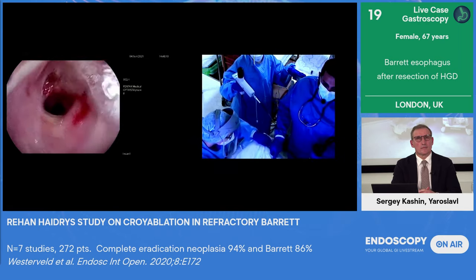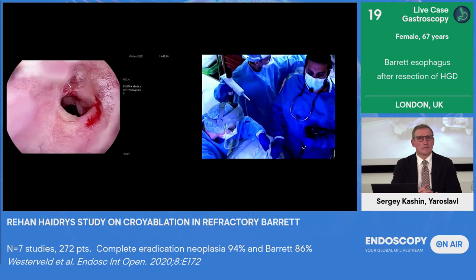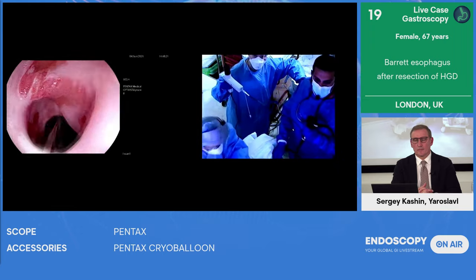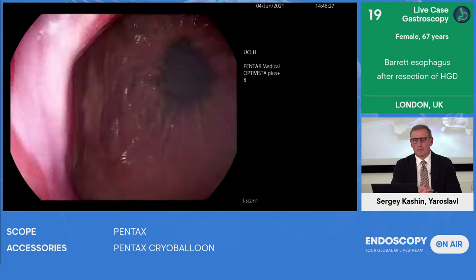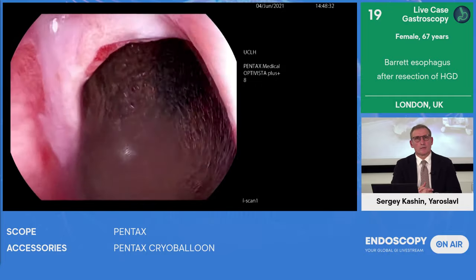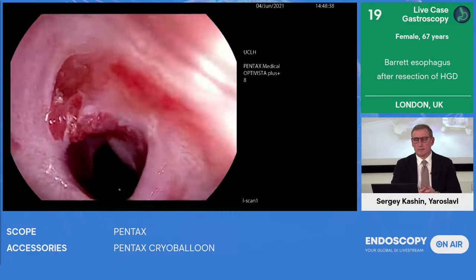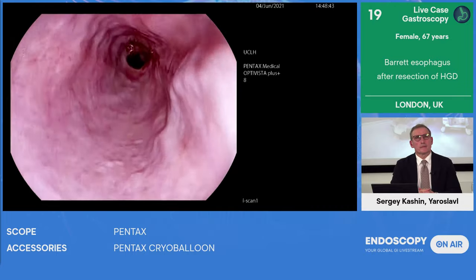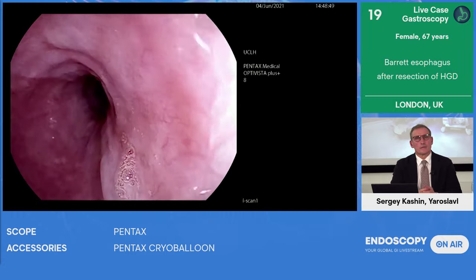And so actually, I'm going to just call it a day here because you can see this lovely deep red, burgundy appearance, which shows these areas have all been treated. Within the stricture here, you can see how it's beginning to discolor from the mucosal hemorrhage. And you can see we've treated circumferentially around the GOJ within the stricture, and also this end here at the oral margin. So this patient will now go home today. We'll get them back in about 3 months, and they'll probably need a bit of a touch-up.